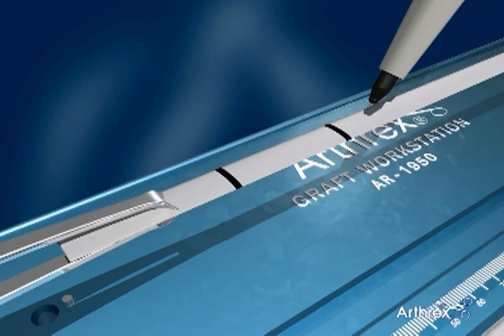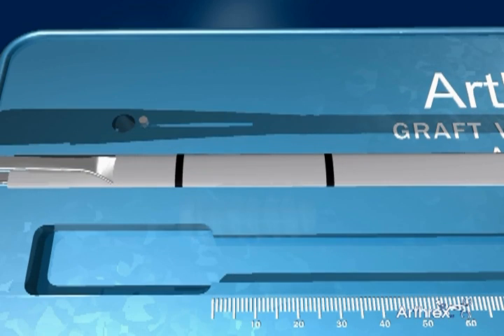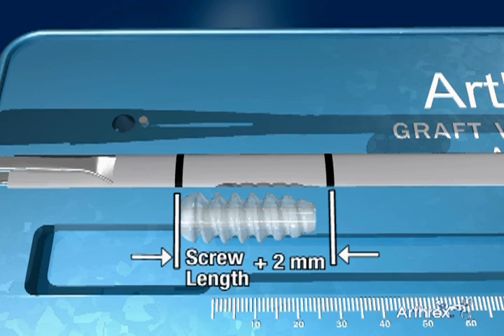For most tenodesis applications, the sutured section should be one to two millimeters longer than the desired tenodesis screw. Notice that some excess length is beneficial between the clamp and the first marked line.